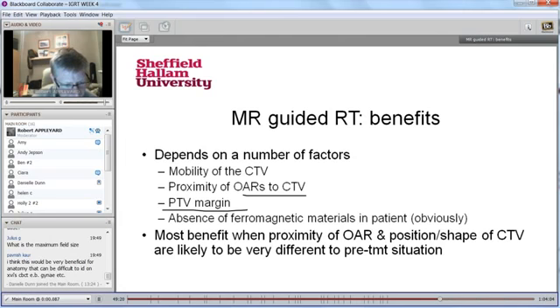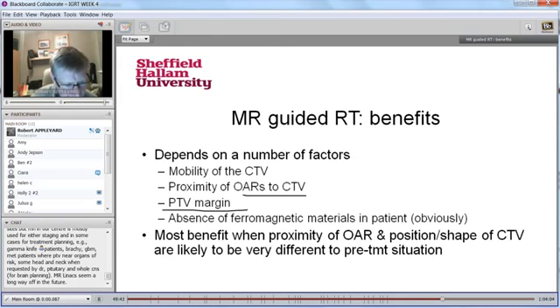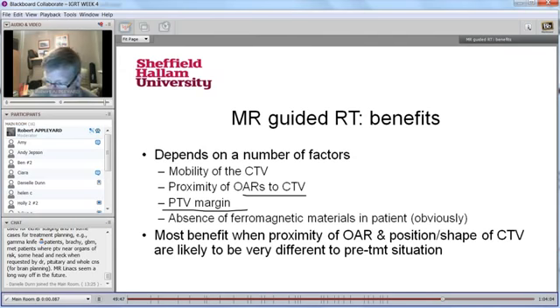How does it affect dose? Well, skin dose is going to be higher. With planning systems, if using adaptive systems, if using Monte Carlo, I guess that's incorporated. I'll try to click through these, I'm starting to lose track.